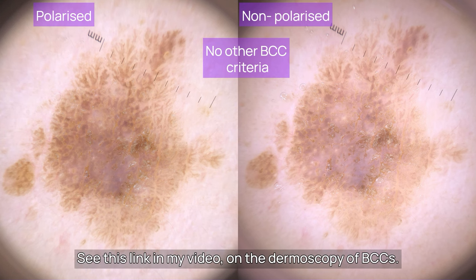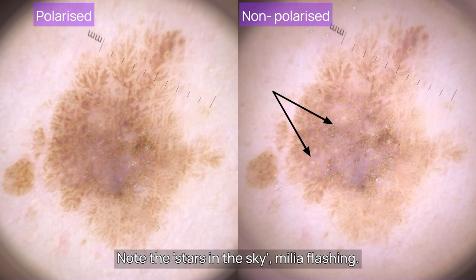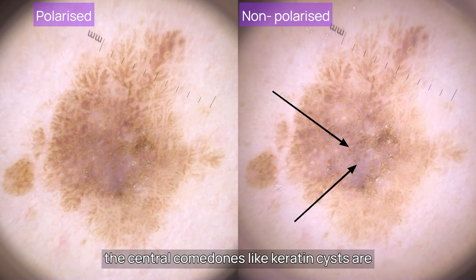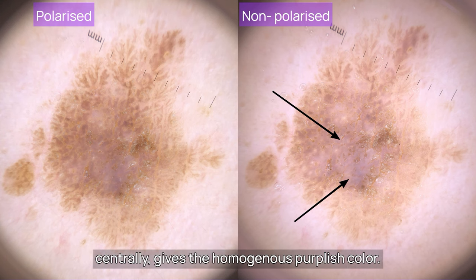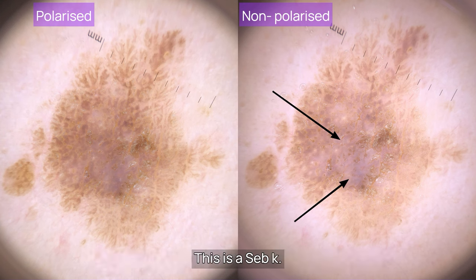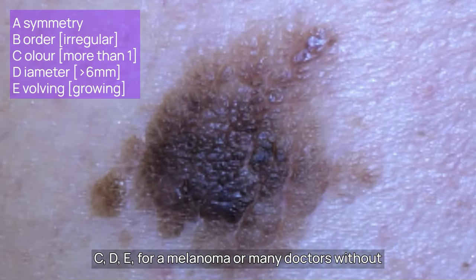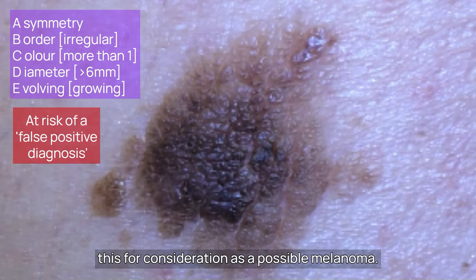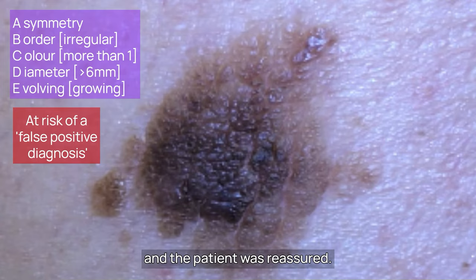Note the stars in the sky milia flashing as I switch from polarised to non-polarised dermoscopy. The central comedone-like keratin cysts are formed in the centre, and fusion of the retia ridges centrally gives a homogeneous purplish colour. This is a Seb K. However without a dermoscope it ticks ABCDE for a melanoma, and many doctors without dermoscopy skills would have had to send this for consideration as a possible melanoma. Dermoscopy makes the difference — and the patient was reassured.